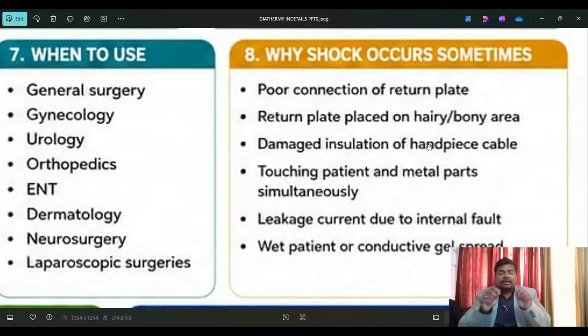Okay, see, touch the machine, sir, I want to know the repairing. All these things may raise doubts the next day. Understand? That's why you have to focus on skills and main functions. If you do that, then at the end of the day you will become a hero. One equipment problem comes to us: sir, diathermy not cutting, sir. Not coagulating, sir. Next, earthing patient plate not working, sir. If you depend on seniors for everything, then you cannot grow your life faster. That's why you have to follow the seniors' instructions, and at the same time you have to learn everything on the back end.